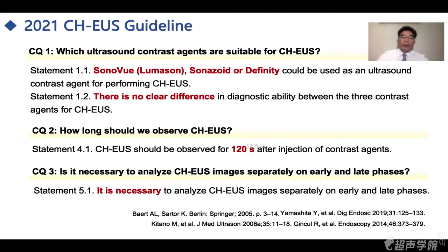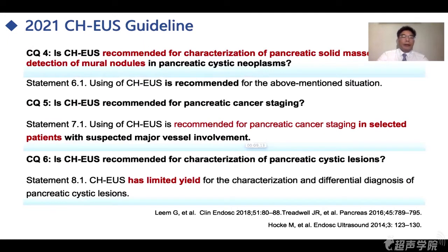CHEUS should be observed for 120 seconds. 4. It is necessary to analyze the early and late phases separately. 6. CHEUS is recommended for characterization of pancreatic solid masses. 7.